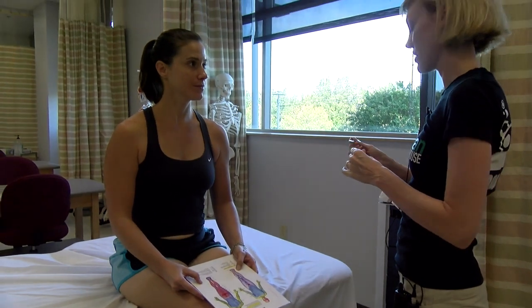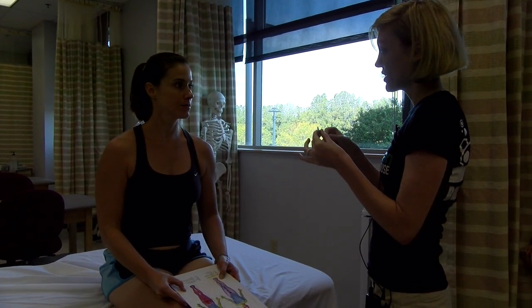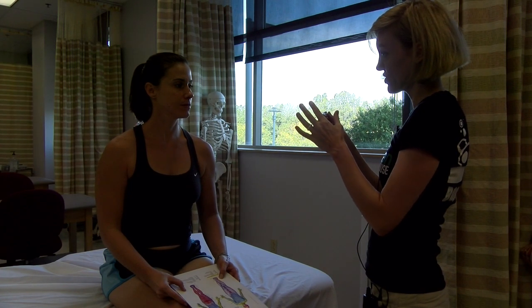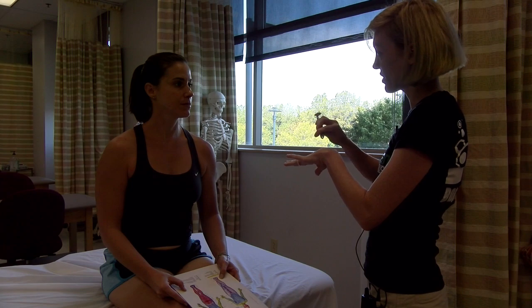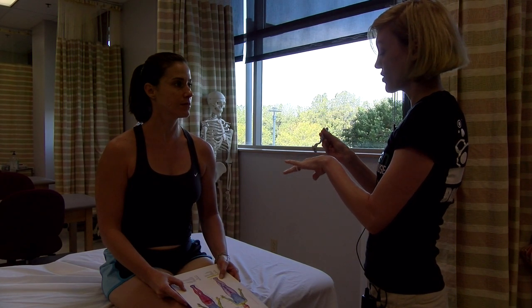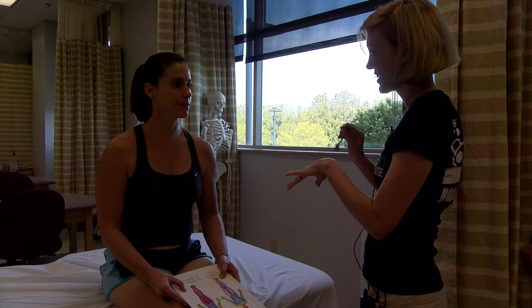We're going to do a test today to test your sensation of feeling sharp and dull. So I have this instrument here. One side is sharp, the other side is dull. And I'm just going to touch you with one or the other side like that. And whenever you feel it's sharp, you say sharp. And if you feel it dull, you say dull. Okay?